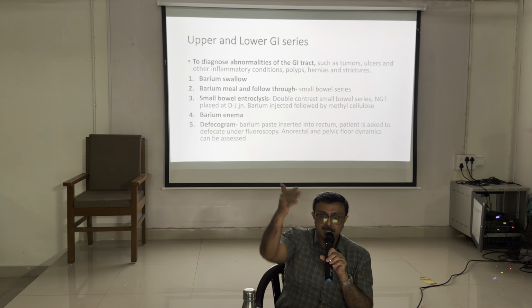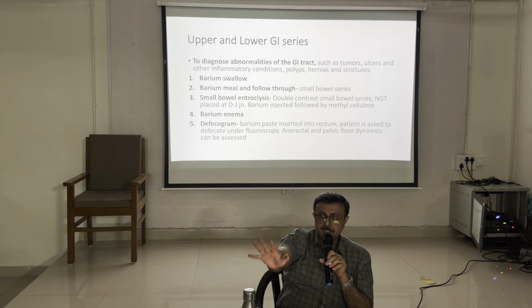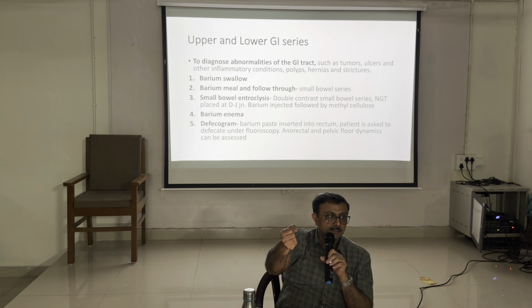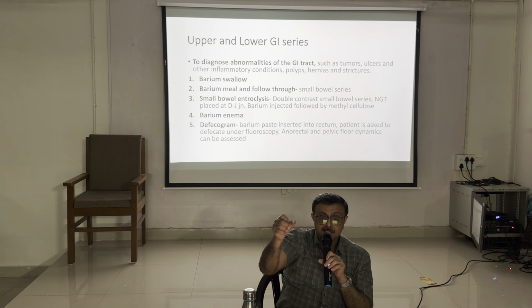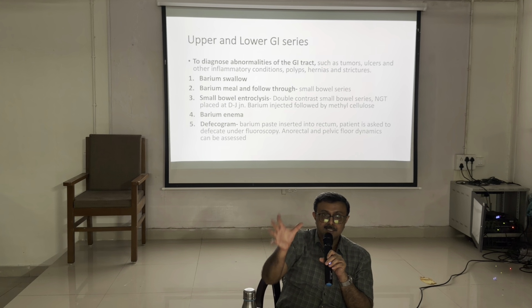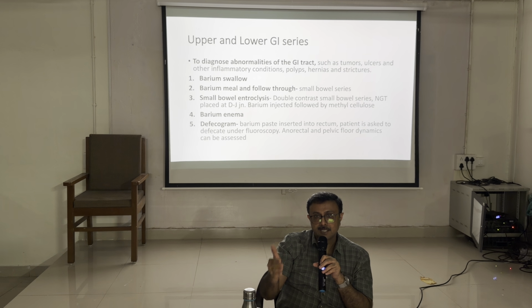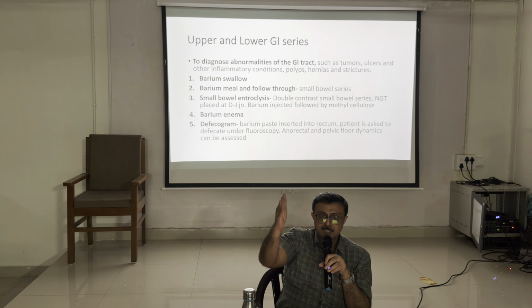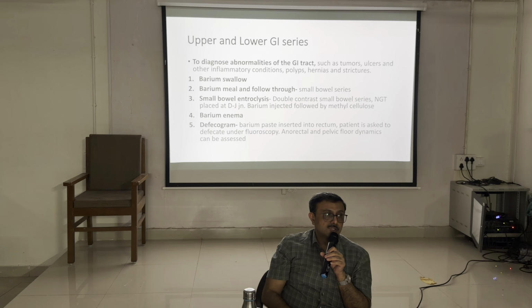Okay? So in real time, barium is passing, and we see how it is passing, what kind of luminal condition, how it contracts. Is there any narrowing? Is there any hyperperistaltic activity? Some signs are there. How it contracts, how it is passing, what time it is taking, is there any stagnation, is there any perforation or any leakage that we can see. So as barium is passing, it can catch the functional condition of the esophagus.